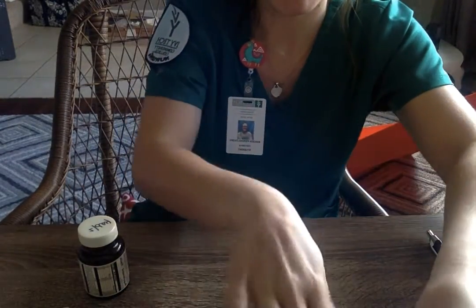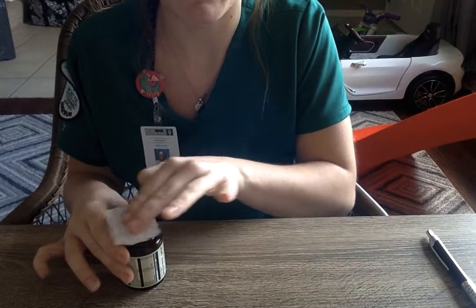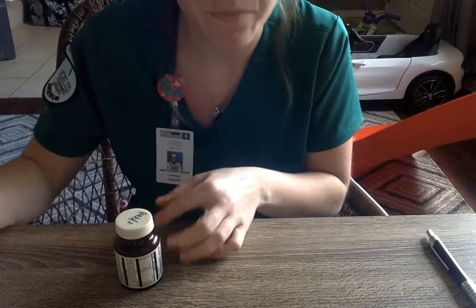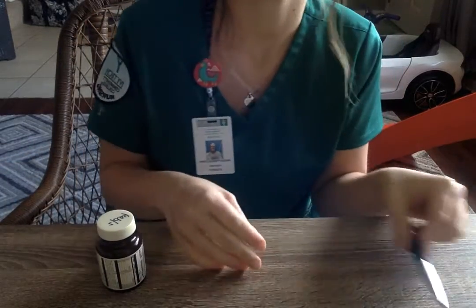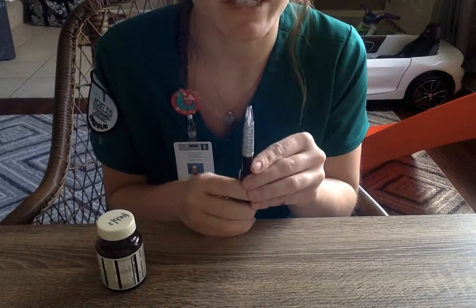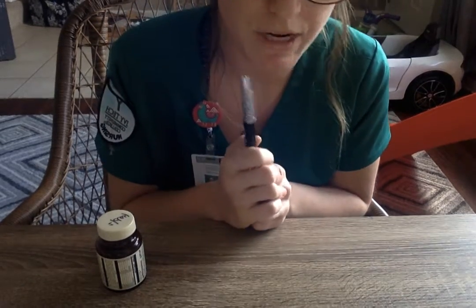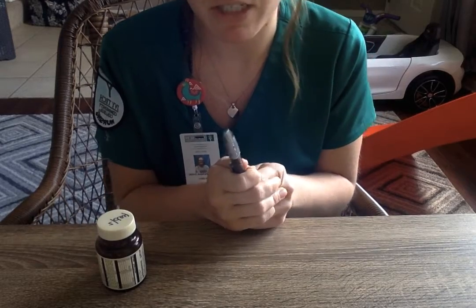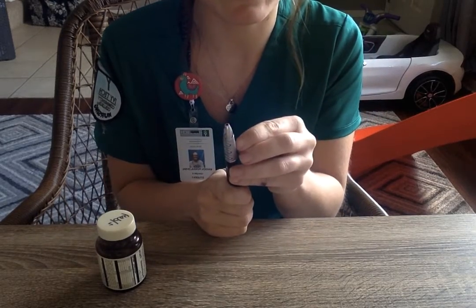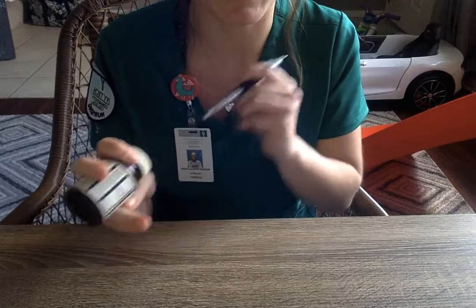Okay, so the first thing that I would do is I would take, there we go. Get the MAR out of the way. So the first thing that I would do is I would take my alcohol swab and I would swab the top of my vial like so. Okay. Then I am going to take my syringe, and I'm going to pull back 6 units of air. So when I pull back the 6 units of air, I want to make sure that I go very slow and that I really am on the 6 unit line, because this vial acts as a vacuum. So what I push into it is what I will initially be pulling out of it.